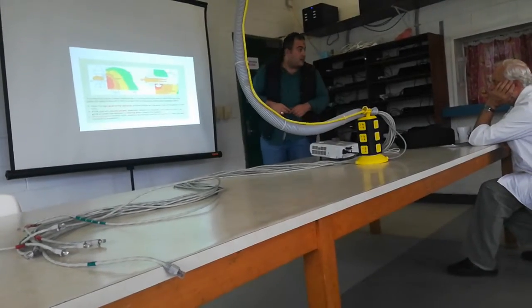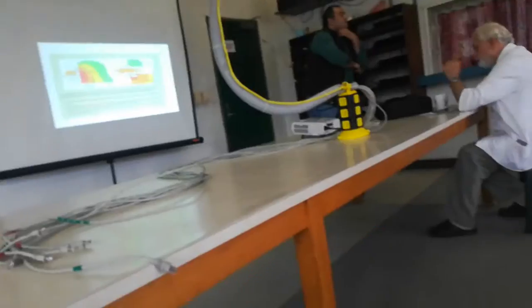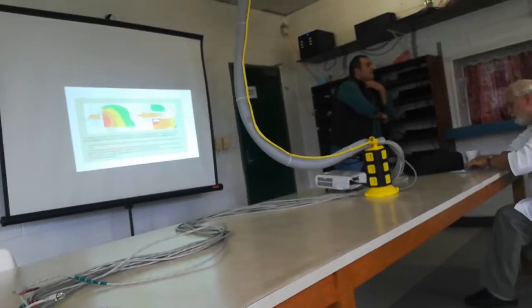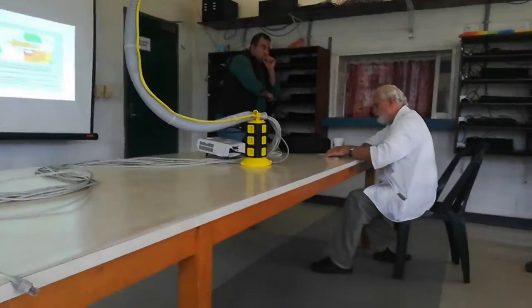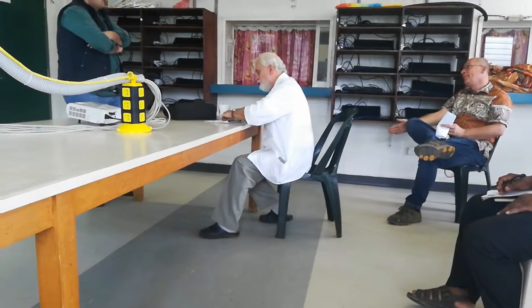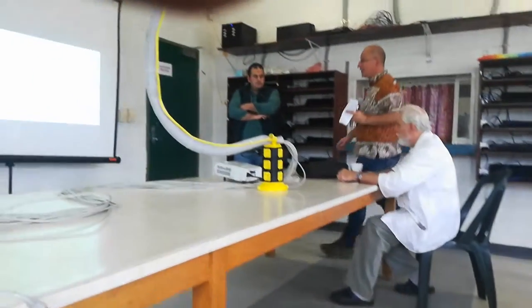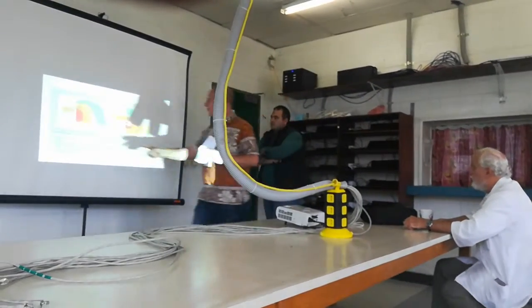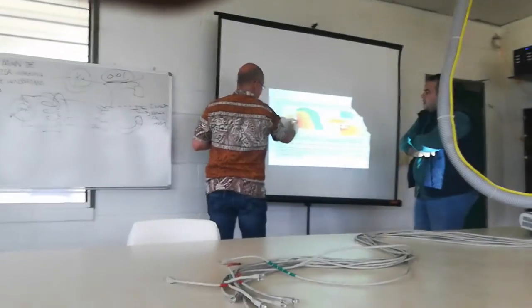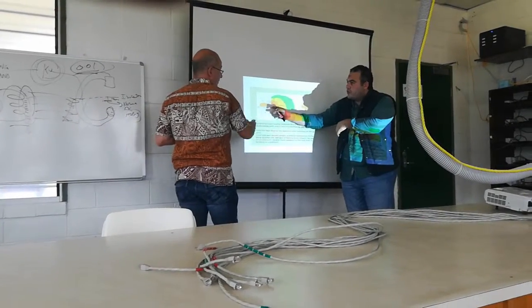I've seen in Germany that frequently they have lead curtains hanging down on the side of the operating table, especially for cardiologists. Yes, we can use a shield in this region to reduce the scatter radiation.